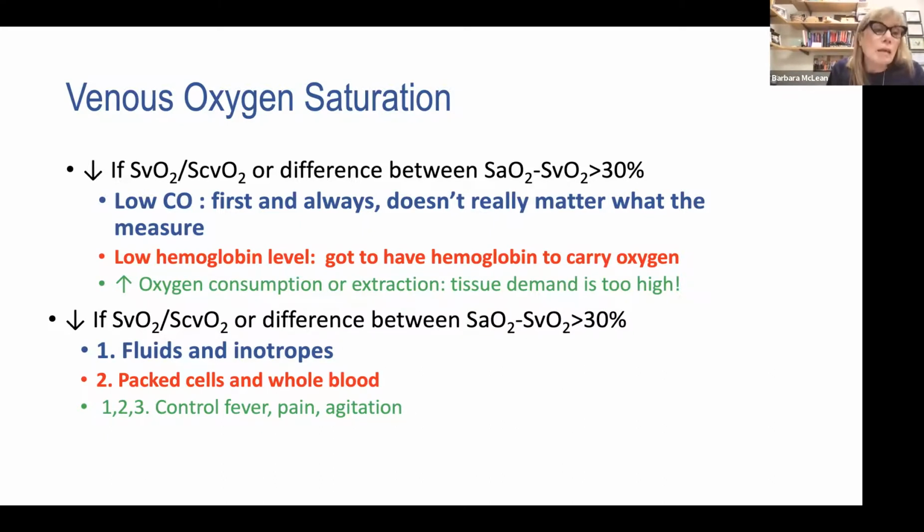Is it costly? Yes. Is it as costly as 8 days in the ICU and then dying? No, it's not. So we got to kind of get past the cost of the blood gas and understand the human cost and the long-term cost of being in an ICU bed for a long period of time.